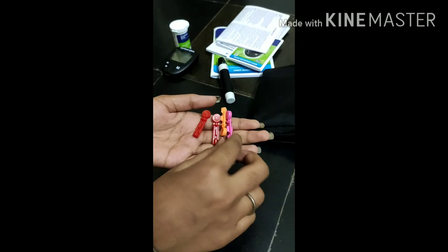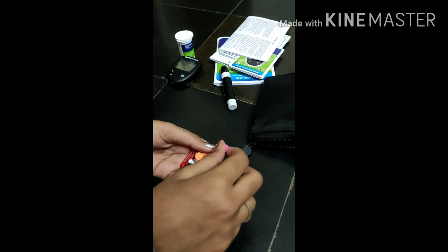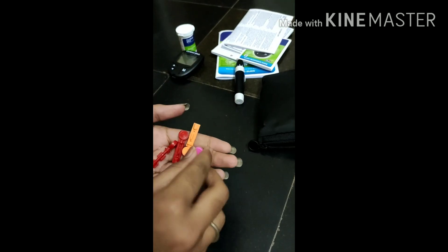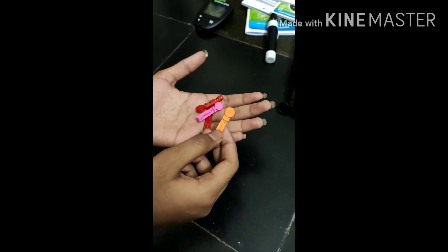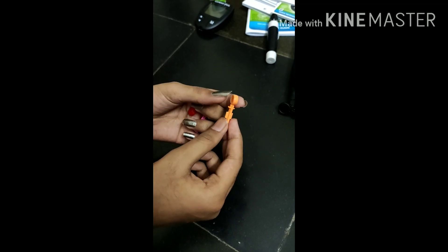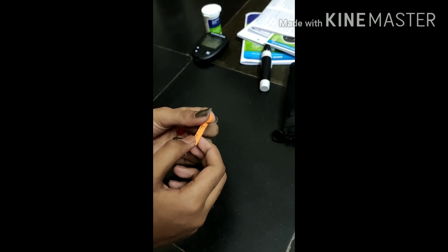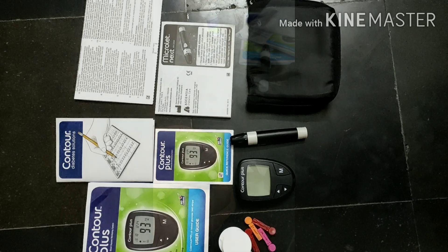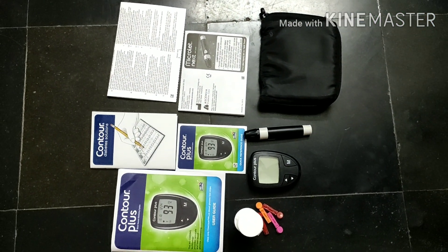Next, these are the lancet needles — they give you five. I had already inserted one before. Only one person can use a needle, and you can use it up to ten times, but you should not share the same needle between two people.